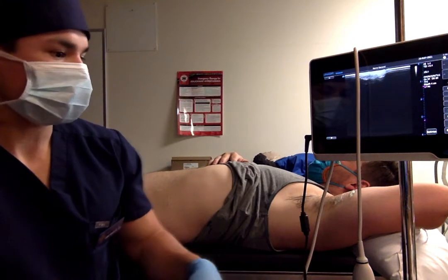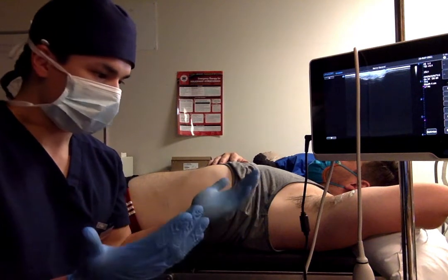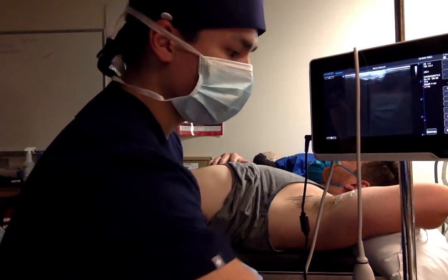So I'm going to gather my sterile supplies. I'm going to open up my sterile prep, put on my sterile gloves. I'm going to grab my prep to clean my patient.